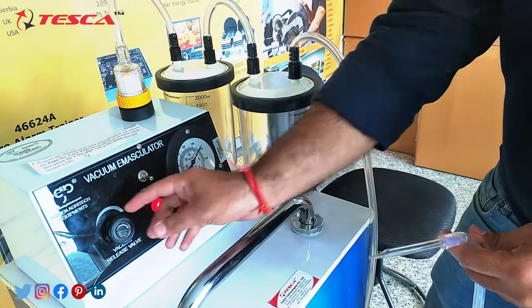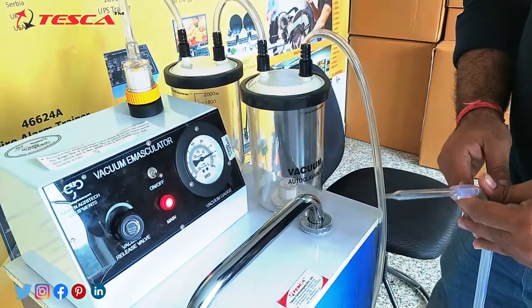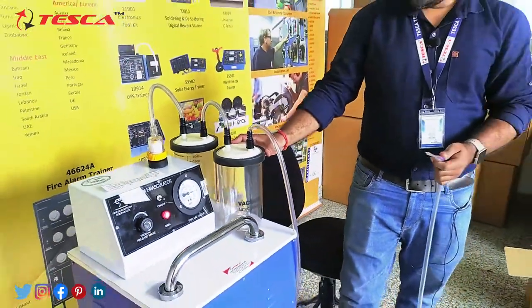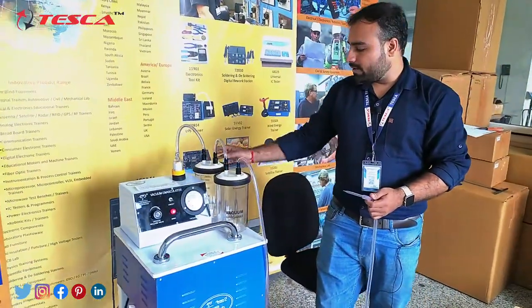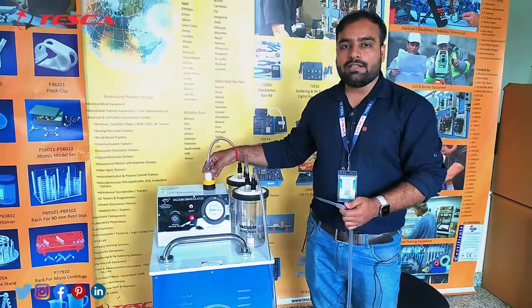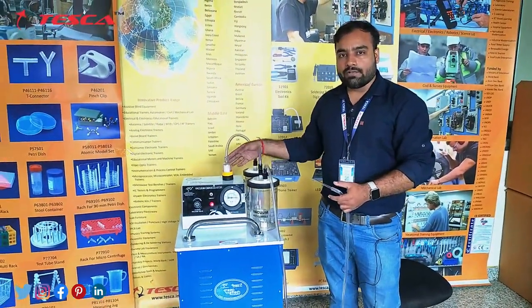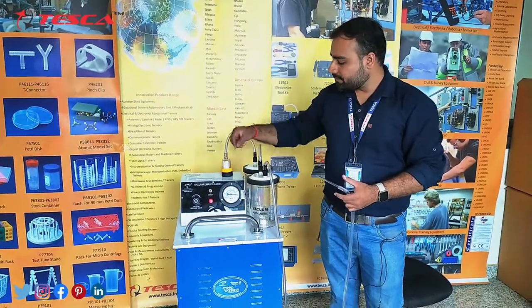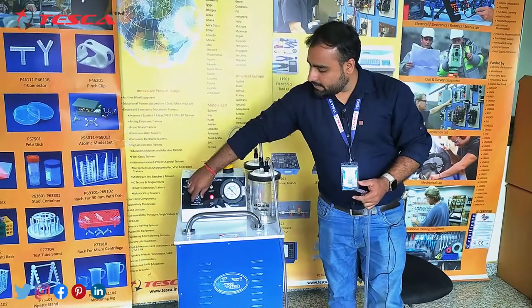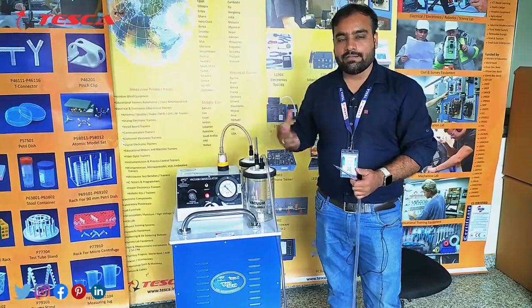As per the desired pressure, you can set and start your emasculation process with this machine. All the collected anthers will be stored in the autoclaveable jar, and a vacuum filter is provided so that dust and other particles from the suction are prevented from going towards the pump. After working with the complete machine, you can easily release the pressure, turn off the machine, and the pressure will return to zero position.